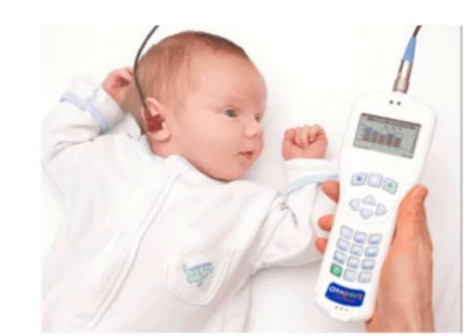Auditory neuropathy spectrum disorder, ANSD, is one of the most common retrocochlear pathologies evaluated by OAE. It often presents with absent or severely abnormal ABR, poor word recognition, and absent stapedial reflexes. However, OAE may be absent if retrocochlear masses impinge on the internal auditory artery and compromise the blood flow to the cochlea. OAE may also disappear over time in patients with ANSD.